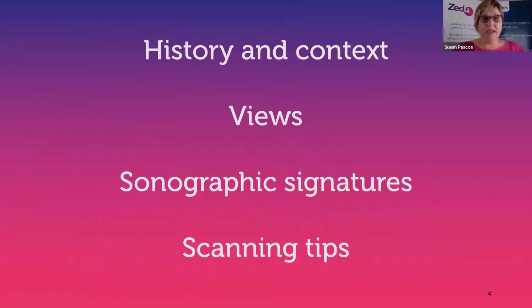So if we make a start on the RUSH, first of all, we're just going to go through a bit of the history and the context, and then we'll take a look at the views and what views make up the RUSH exam, look at each of those views and some of the normal and abnormal pictures or sonographic images, and then I want to give you a top tip for each view.